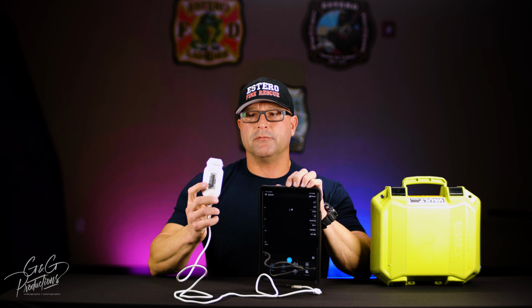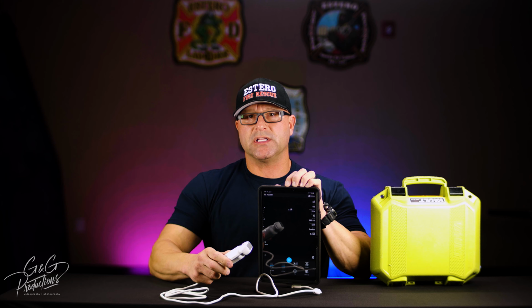The exams we're going to be doing are the PLAX exam, which I just talked about, and the Subxiphoid. I will tell you from experience that the Subxiphoid is the easiest of the exams to do because of the positioning of the probe marker and the orientation of the probe itself, right? It's just a lot easier.